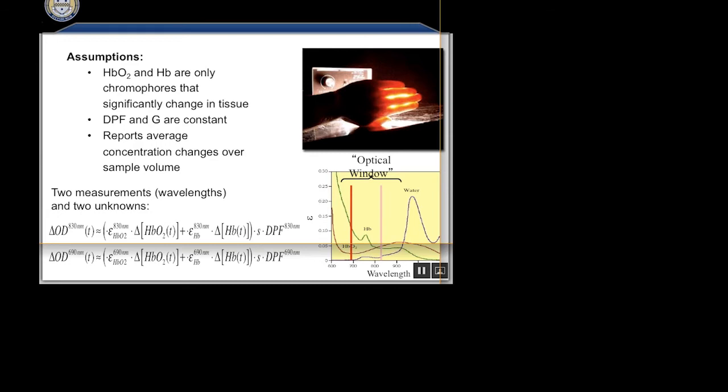But it is definitely something to be aware of because every now and again you get a comment for a paper review or something dealing with crosstalk between oxy and deoxy that you have to address and then go point to this Gary Strangman paper.